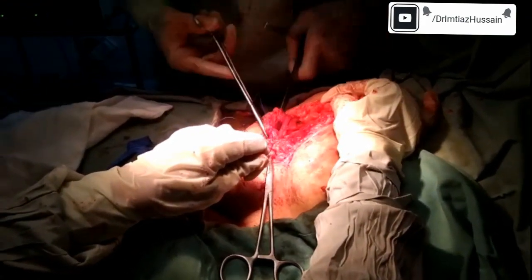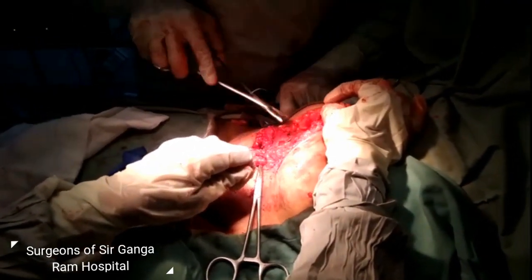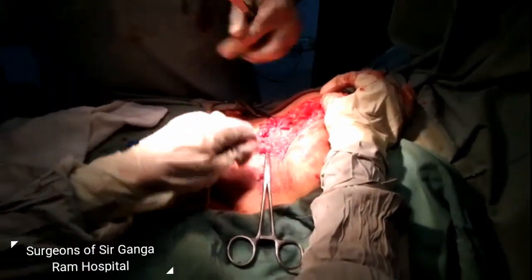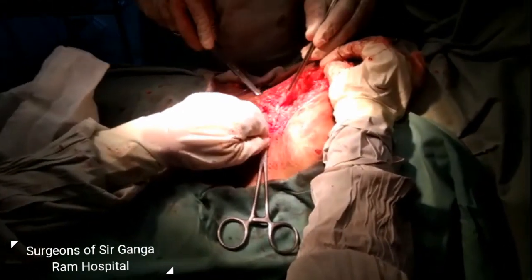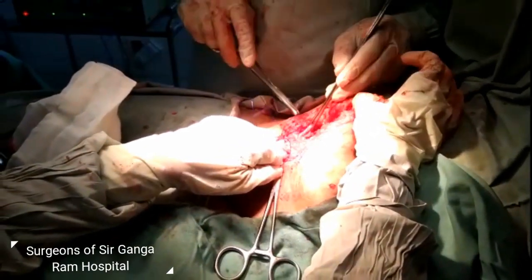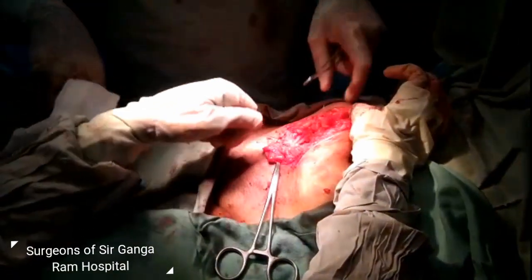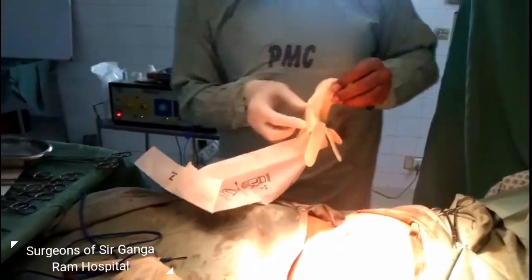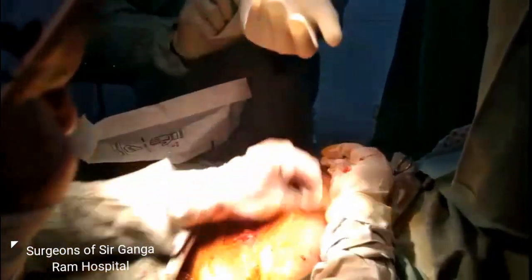If there is a fibrotic ring or heavy tissue around the defect, we can proceed with primary tissue repair. If there is no need to excise the sac, you just have to reduce the sac and cover the defect with Prolene 1. If there are adhesions and contents, you will have to open the sac, excise it, and break adhesions between the sac and underlying organs or fat. In this case, we have to excise the sac.